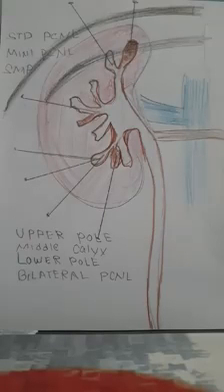I have been using standard PCNL and mini PCNL, as well as super mini PCNL, because PCNL is a very complex topic, and there are lots of advancements in the technology, and also we have a better understanding of kidney anatomy and variable approaches.